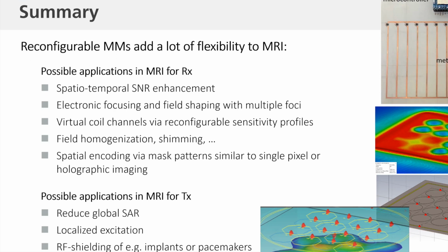Yeah, that's a good point. So we are working right now to better understand which patterns are really penetrating deep enough into our object. If you consider a matrix-like structure where you have individual elements, that would be this one coil, one voxel approach Jürgen Hennig had back then, without the necessity of being able to read out each individual coil.